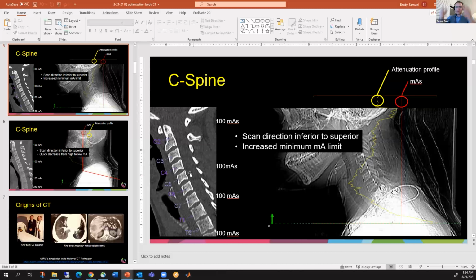If you need to put the arms up for the neck, the other thing you can do is instead of putting them straight up, you can put them out a little bit, so the arms are above the face. But we split ours, personally.